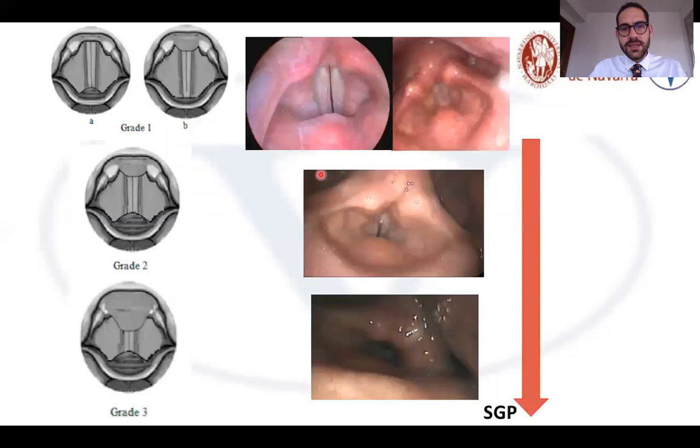With the hypothesis that a greater grade of supraglottic compression might be related to a higher level of subglottic pressure, we divided the anterior-posterior compression into three different grades: grade 1, grade 2, and grade 3. Grade 1 was divided into grade 1A and grade 1B. In grade 1A, we cannot see the anterior commissure during phonation because of the anterior-posterior contraction. In grade 1B, we cannot see the vocal process due to the rotation of the arytenoids during the speech task.